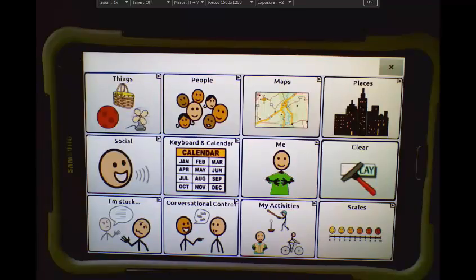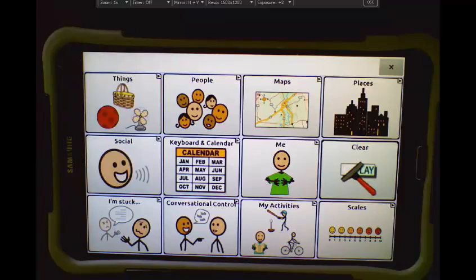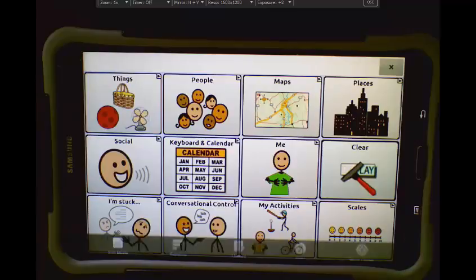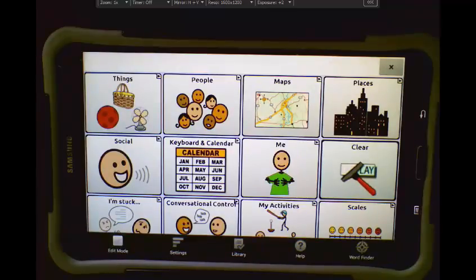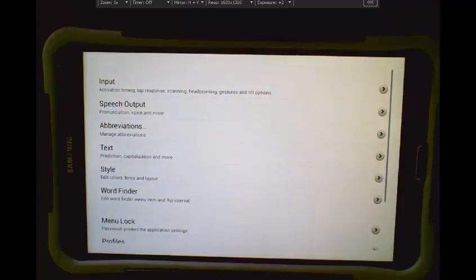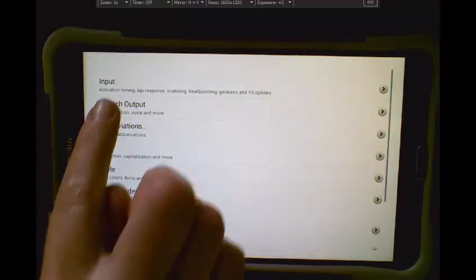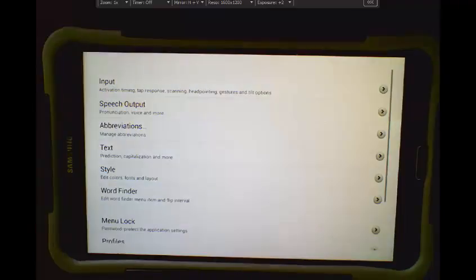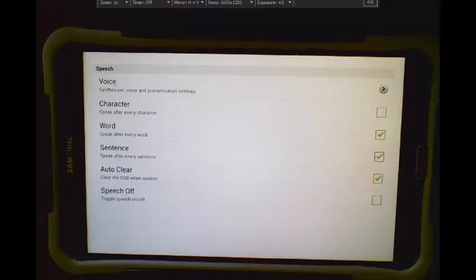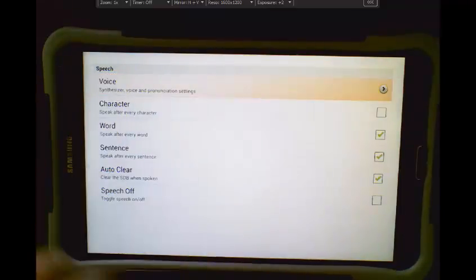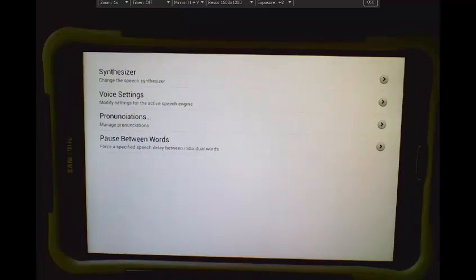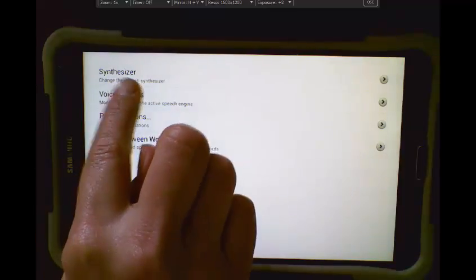I'm using a Novachat 8 for this demo. To access settings, we will tap Menu, tap Settings, Speech Output, Voice, and Voice Settings.